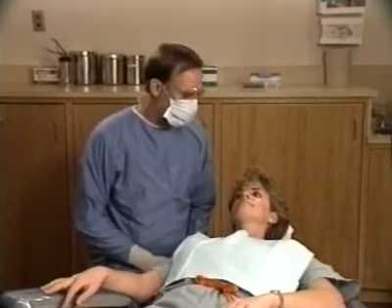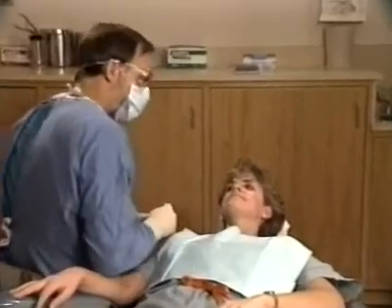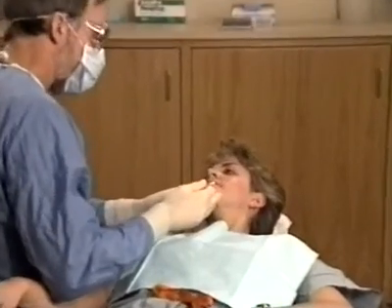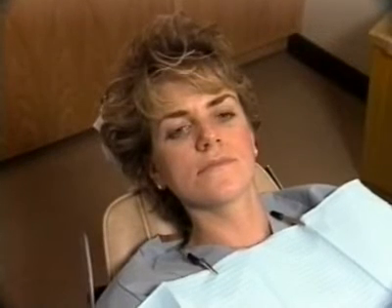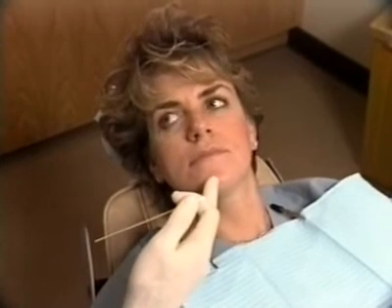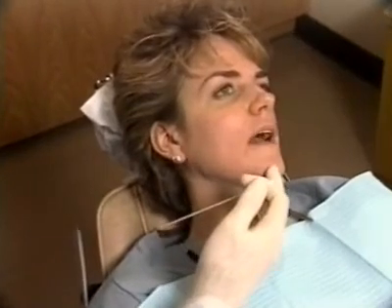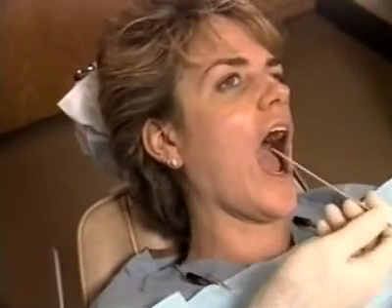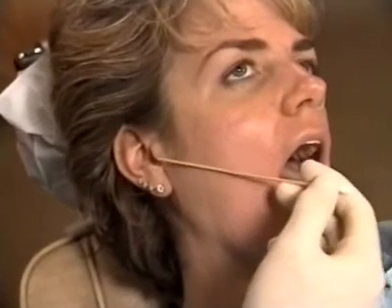The position of the operator and patient for performing a Gow-Gates block of the right mandible is similar to that used for the standard inferior alveolar nerve block, except that the clinician must be able to view the patient's face in addition to the oral cavity. The Gow-Gates technique relies on extraoral landmarks to establish the plane of insertion. With the mouth wide open, the angles of the mouth, the lower border of the tragus, and the neck of the condyle lie in the same plane.